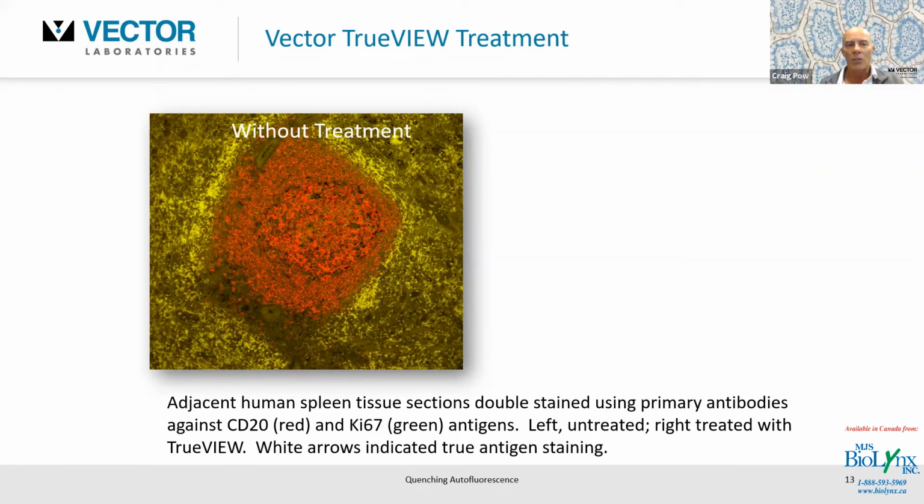So this is actually double stained. It's CD20 in the red, which hopefully you can see, reddy orange, and then Ki67, which actually you can't see in here. They're like little pinpoints hidden in here. It's a mitotic marker, Ki67. You can't see them without reducing the autofluorescence.